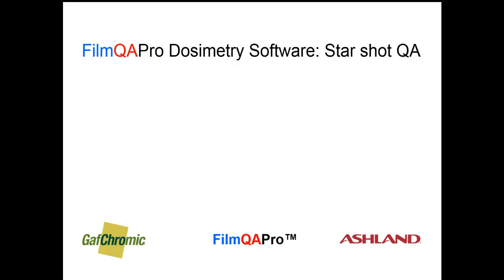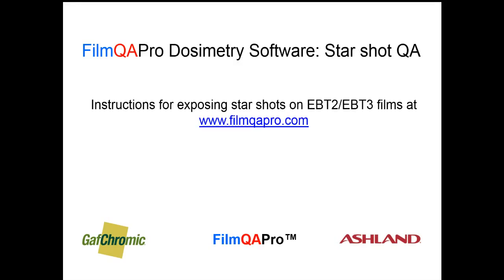This module describes the use of FilmQA Pro to analyze a starshot image, and a protocol for recording gantry, collimator, and couch starshots on radiochromic film is available on the filmqapro.com website.